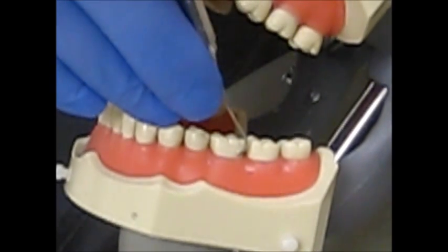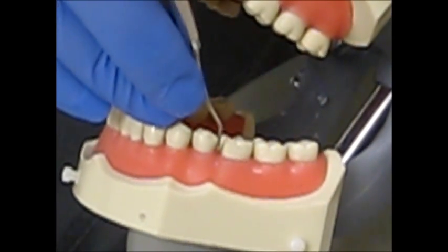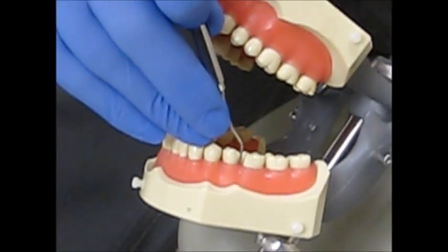When you rotate, the last bend in the shank will be towards the tooth, and as you complete to the mesial interproximal, it will be parallel with that surface.